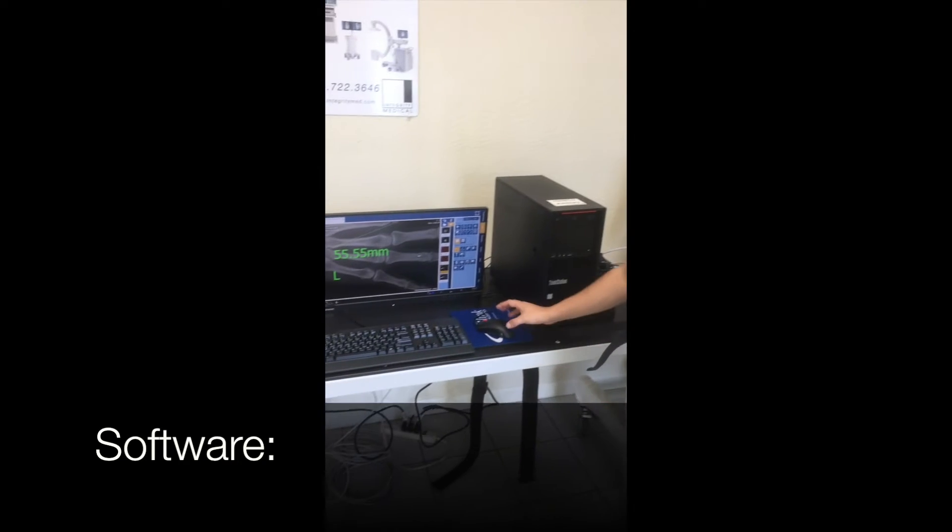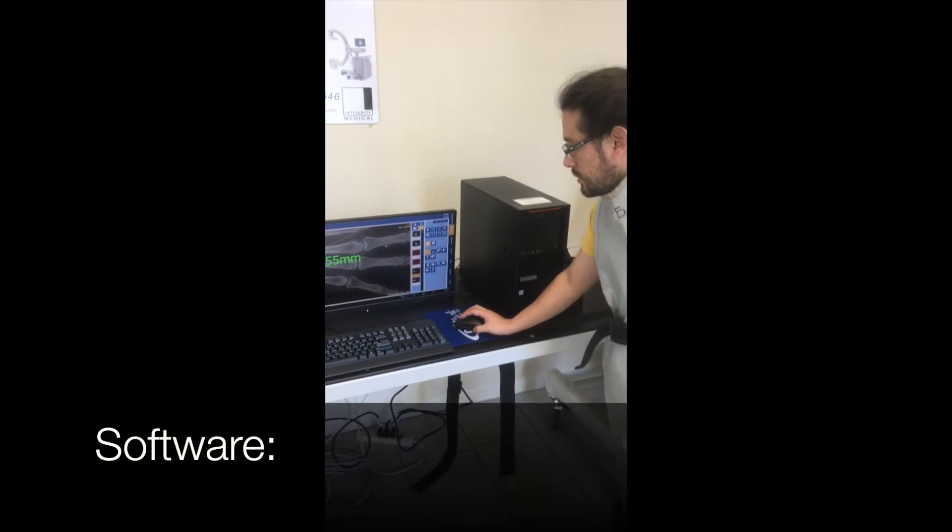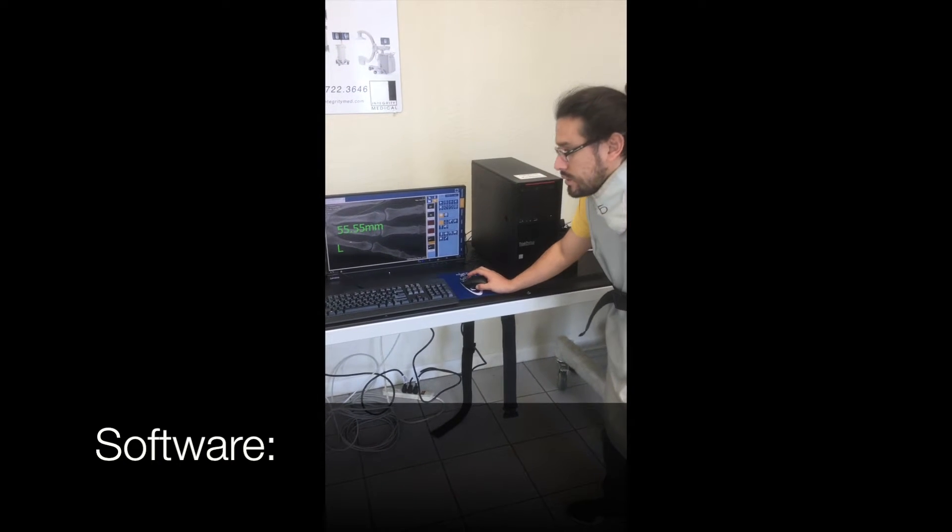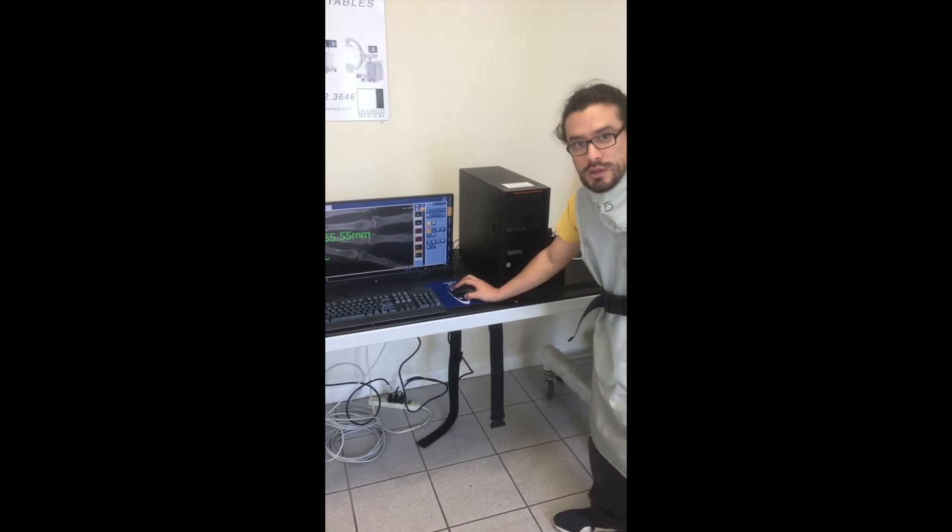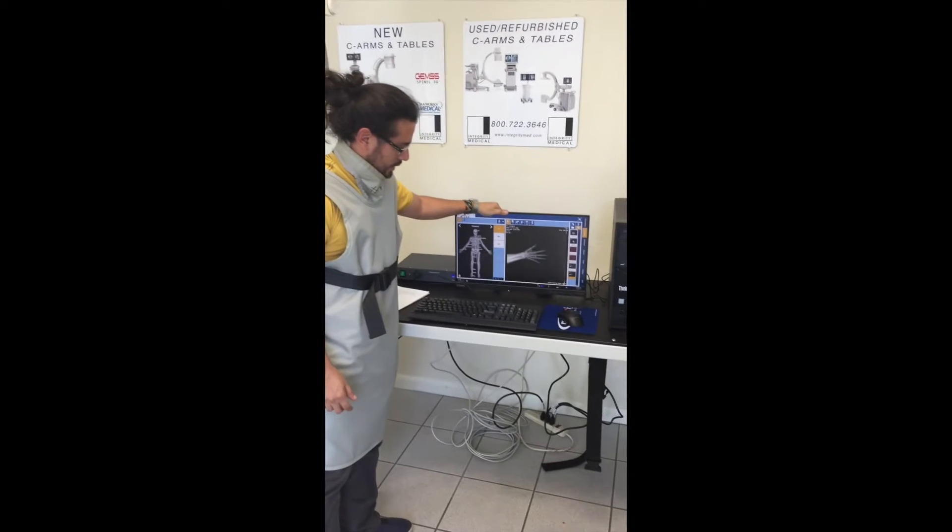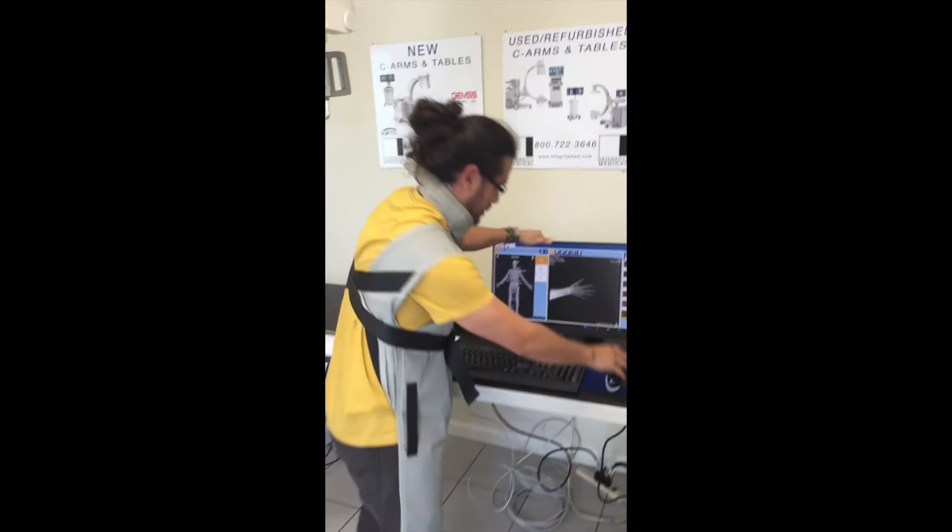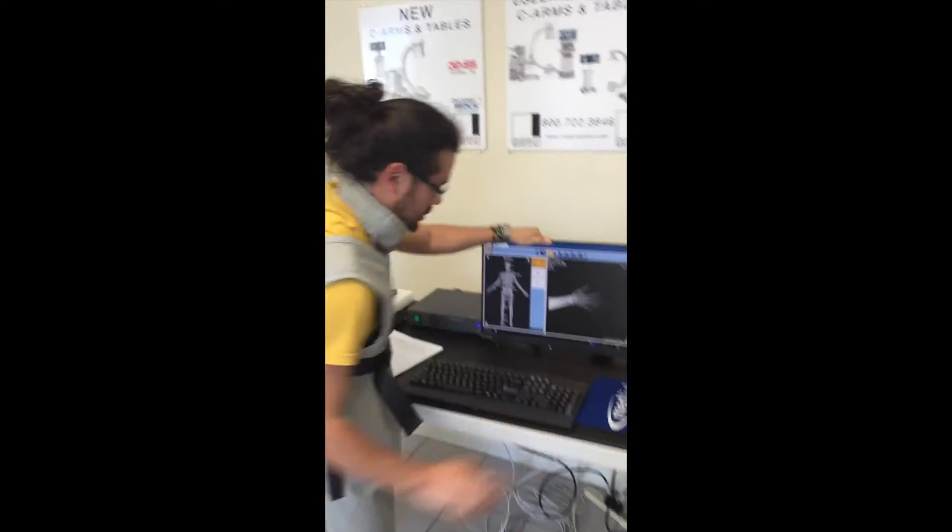Very intuitive, very intuitive to maneuver. And you can get it here at Integrity Medical. See how good the quality is and how quick it is to achieve an image.